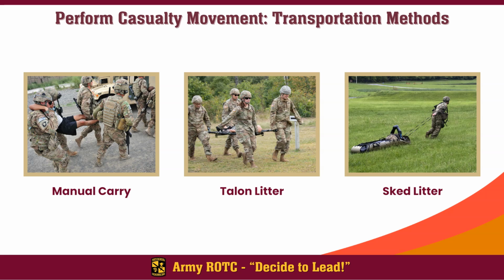It's flat, it's got the nice strong poles, and then you've got the SKED or the SCEDCO litter. From my experience in ROTC as both a cadet and a cadre member, this is the most annoying way to carry because it doesn't fit right on your gear, it's hard to carry around, and it's more of a drag. So I consider this more like a sled, but that's another way that you can move a casualty.